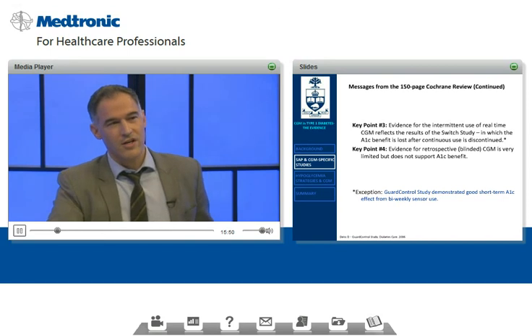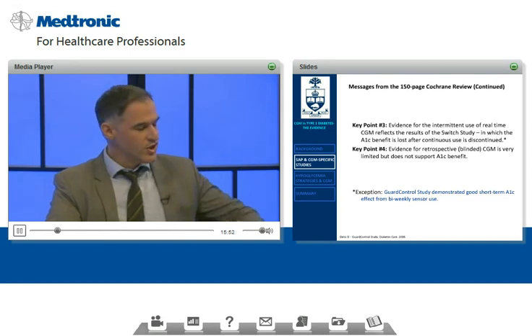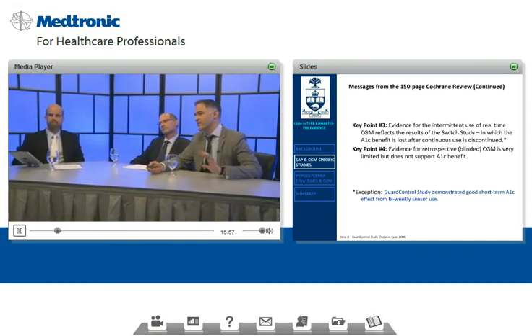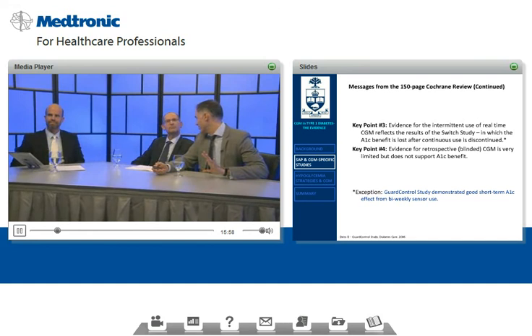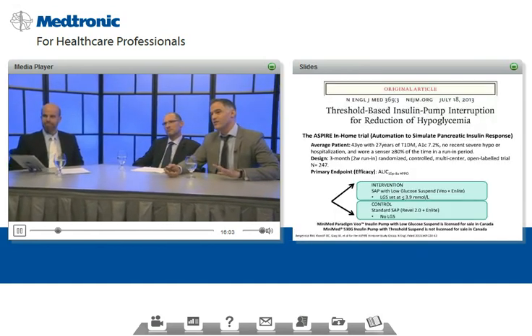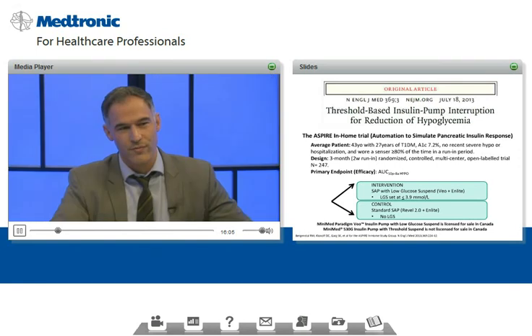All right, now I'd like to talk about CGM when it's applied to protocols to help prevent hypoglycemia. And I'd say this is the more interesting part of my 20 minutes. To begin with, there is a publication from July in the New England Journal of Medicine that I hope most of you have at least heard of or seen, but here's your chance to know all the details from it, or the key details.